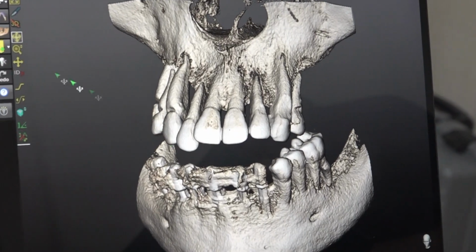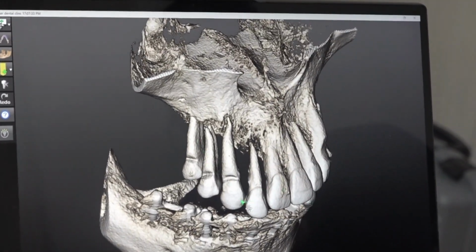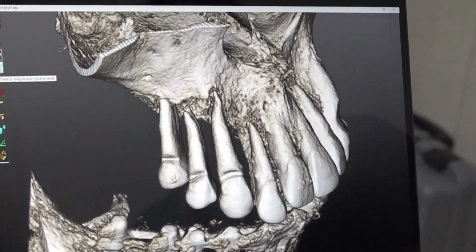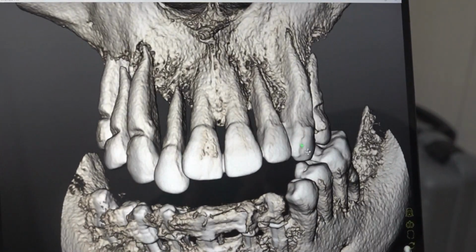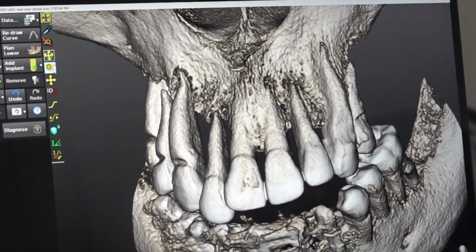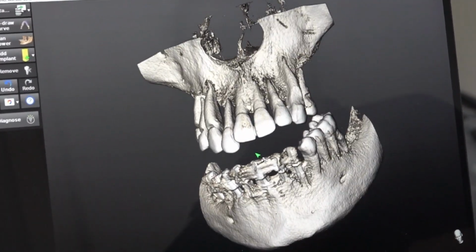Okay, now the patient came for upper. If you see, because of only the anterior chewing the patient is having, all the premolars, canine, there is severe bone loss. Okay, almost gone. So this is the main problem when the patient is having only the anterior chewing.